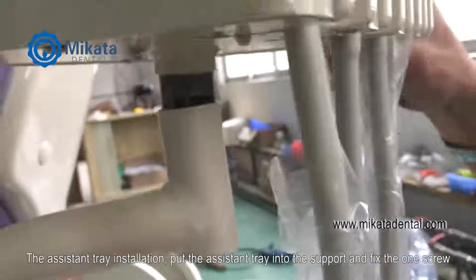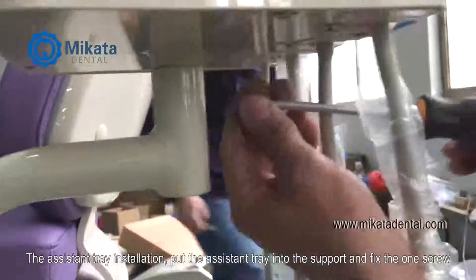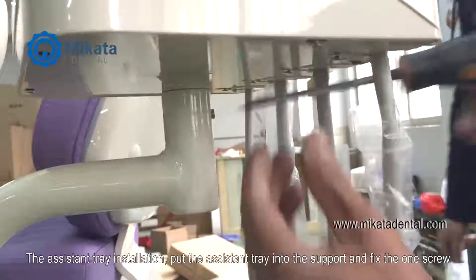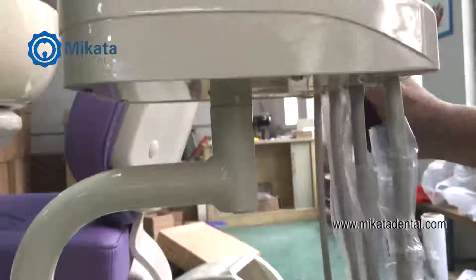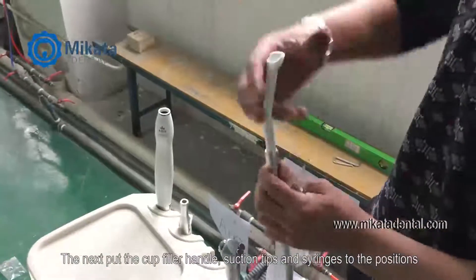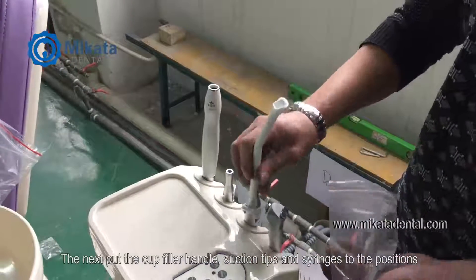Assistant tray installation. Put the assistant tray into the support and fix with one screw. Next, put the cup filler handle, suction tips, and syringes into their positions.